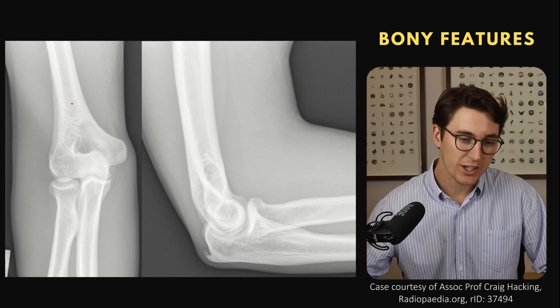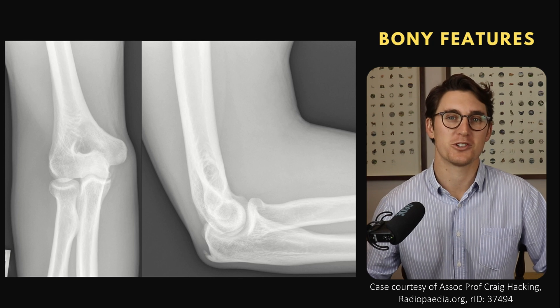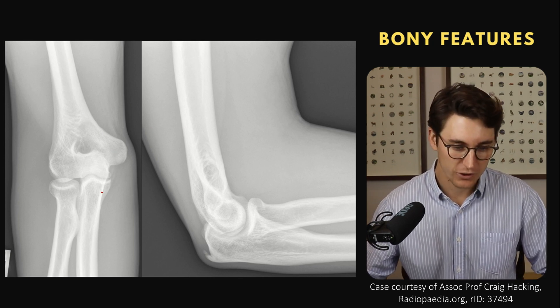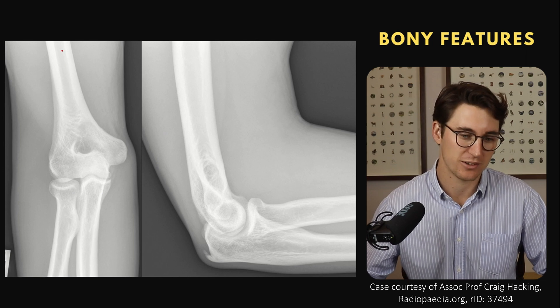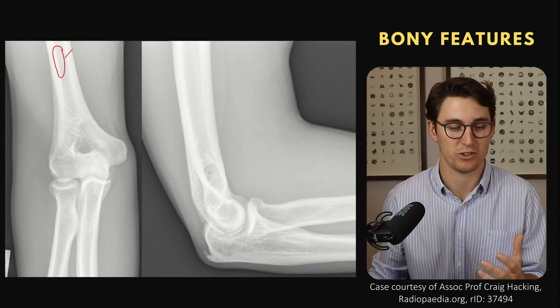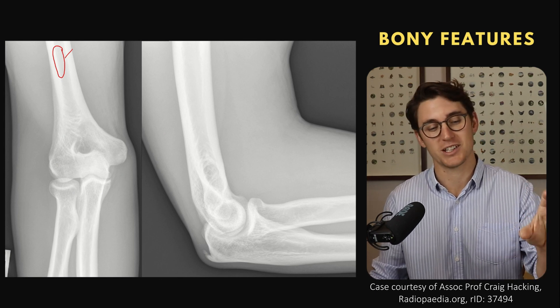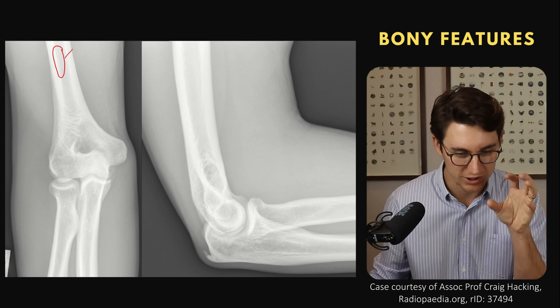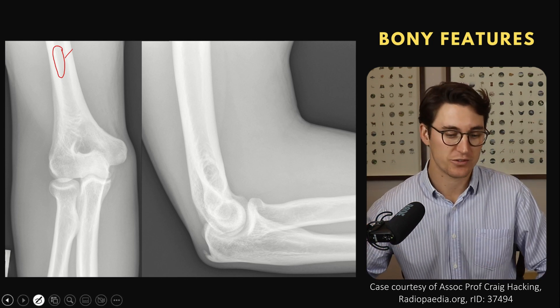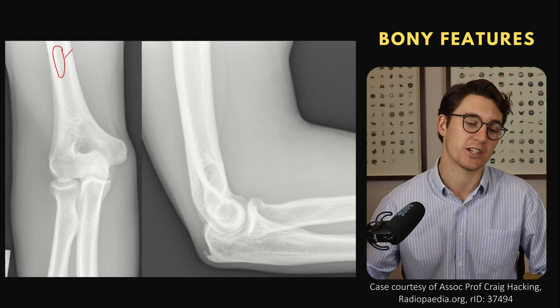First, looking at the shafts of the long bones before you look at the joint is really important. You're focusing all your attention on the joint and there's a big lucent lesion here with a pathological fracture that you miss — that's really embarrassing when you're missing a big lesion while focusing solely on the joint. So it goes without saying: let's look at the shafts of these long bones as well as looking at the joint itself.